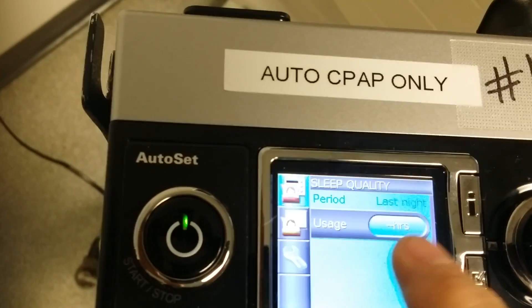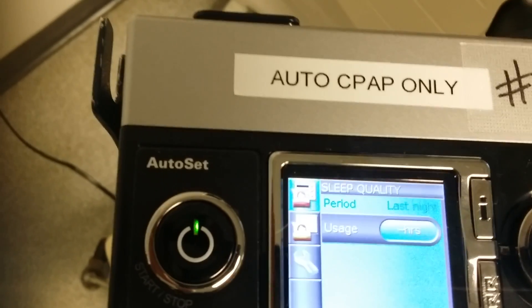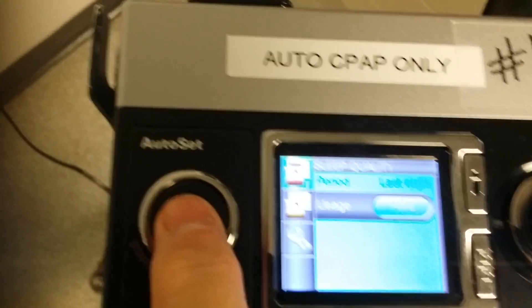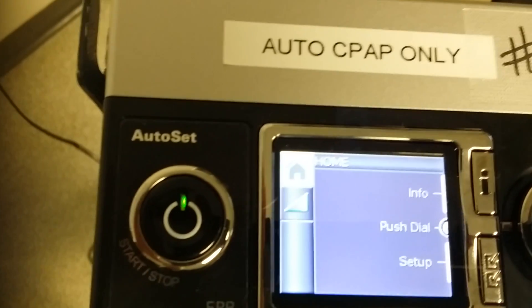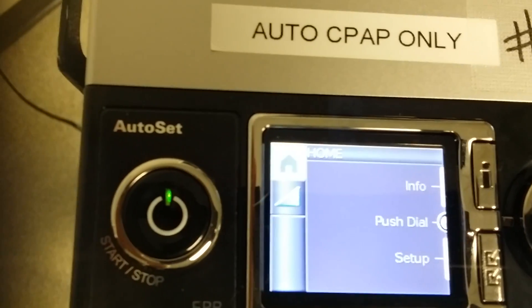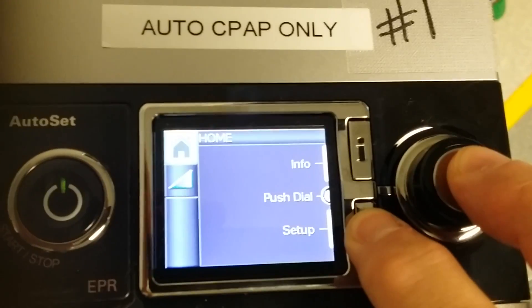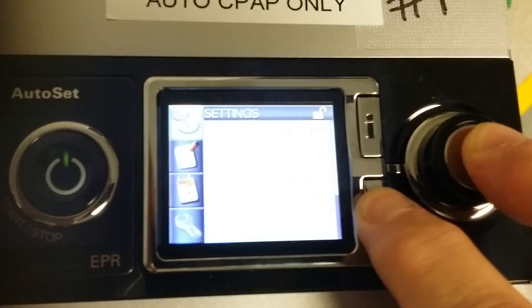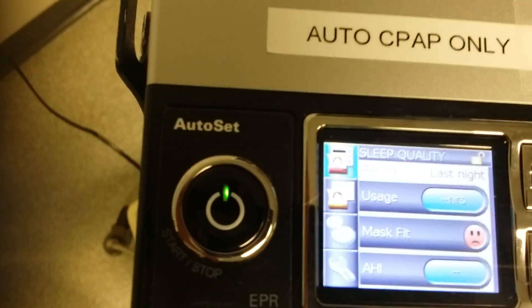This will tell you how many hours they were on it the period last night. If you want to get all the detailed information, go back to the standard power-on with nothing running and do the menu button and the click dial at the same time again to go into the clinician setup. Then hit the info button and look at all the different things available.